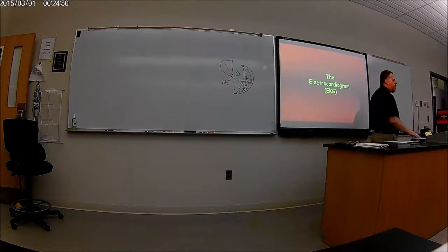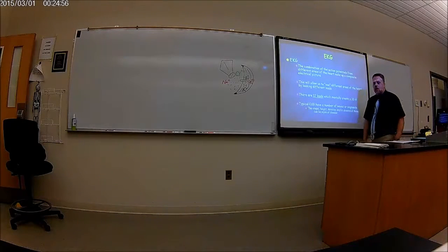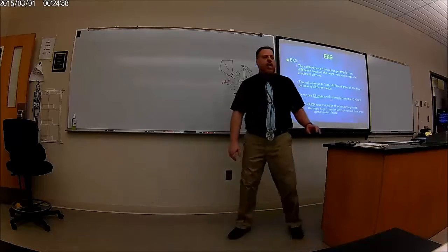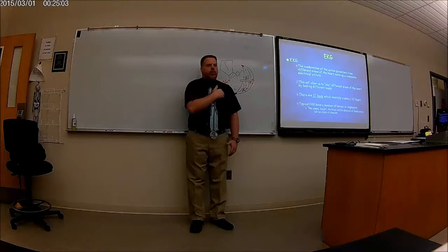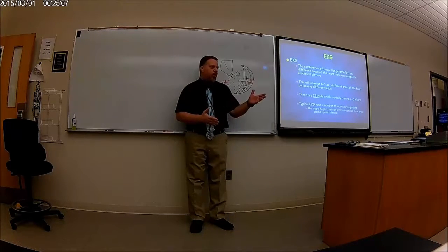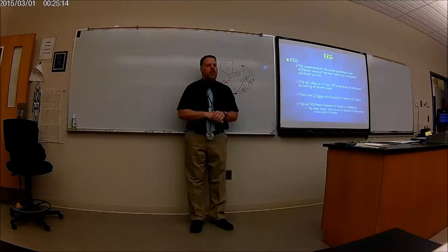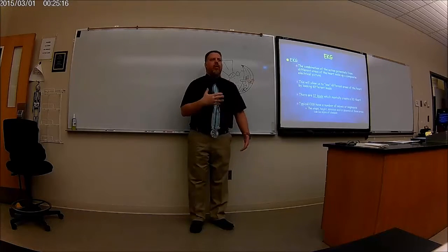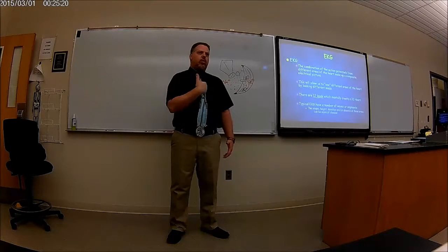So let's talk about the EKG, electrocardiogram. Basically, you know a little bit about EKGs. You know there's going to be electrodes on the person's chest, all right? There's 12 leads that we do, and we have one over here, but we're not going to do 12 leads. We're only going to do 4. These are not the best EKG machines, but you could see things, okay? You're going to have like 12 leads. We have 6 leads that go around on the chest. 1, 2, 3, 4, 5, 6.